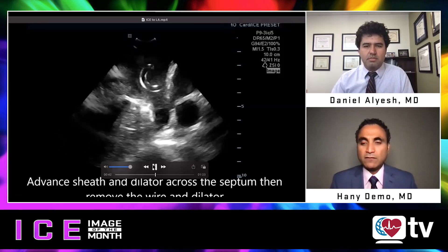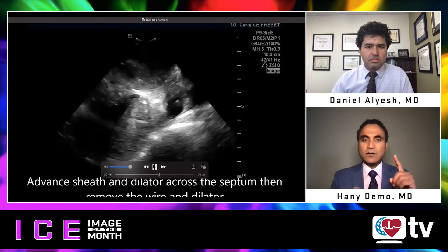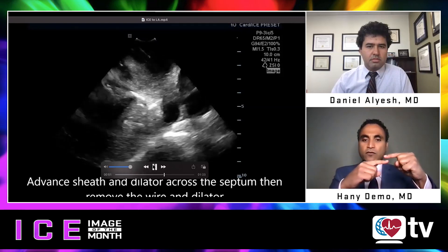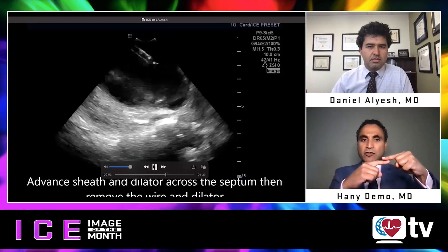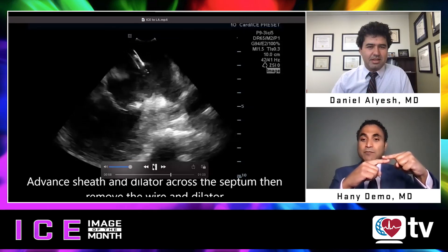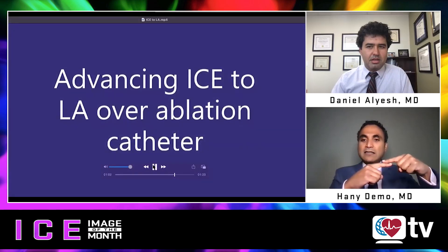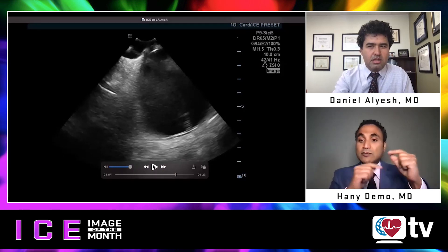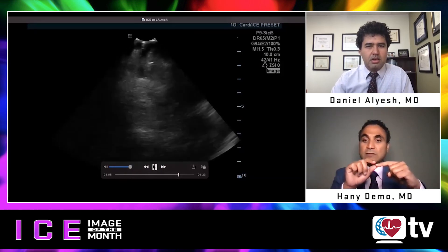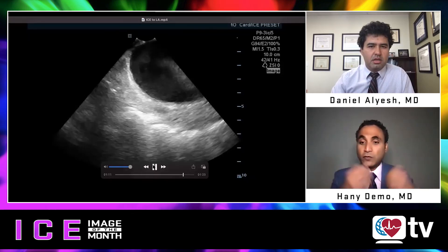Once the transeptal wire is in view, I apply an anterior tilt onto the ICE catheter, which takes the tip of the ICE catheter and brings it over the wire. Once it's parallel, I start seeing the shadow of the wire, and that shadow artifact tells me I'm parallel to the wire. Then I advance the ICE slowly into the left atrium, making sure I'm leading with an echo-free space — meaning I'm not going through a wall or perforating.